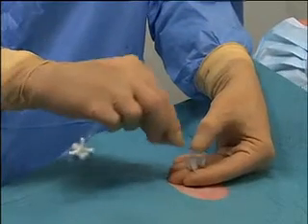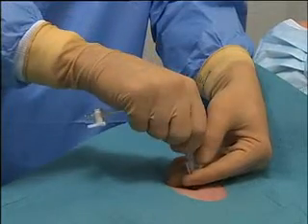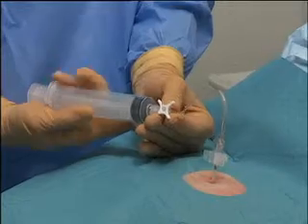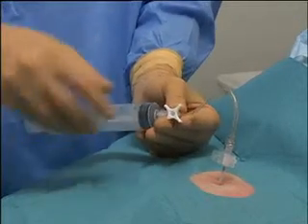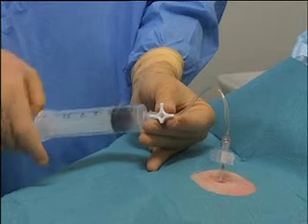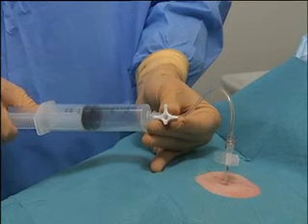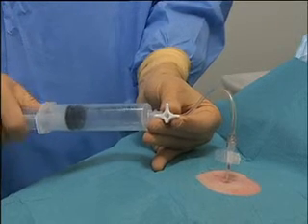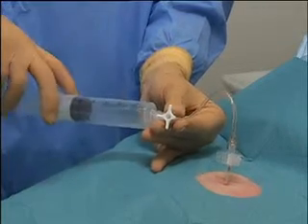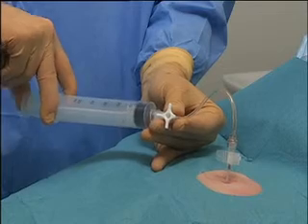Attach the tubing with the 3-way stopcock to the catheter. Use the 50 or 60 ml syringe to gently aspirate the air from the pleural space. Evacuate it through the side port into the ambient air.